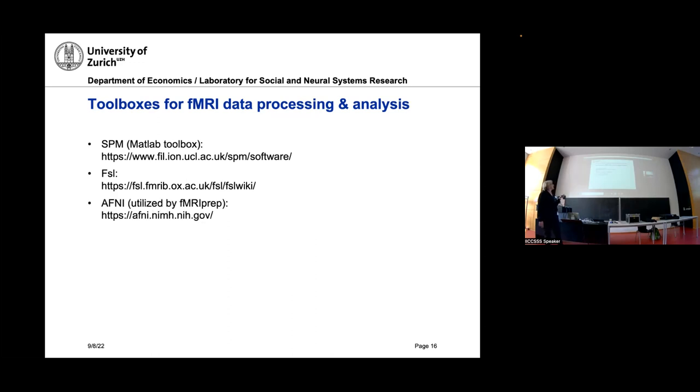Okay, so there's also the AFNI toolbox. And if you think of bad GUIs, this is the best one. So AFNI has been developed in the US. With regard to the algorithms behind, it's quite powerful, but the documentation of AFNI says like the code is documentation enough. That's why this is quite hard for a beginner, but feel free to use it.